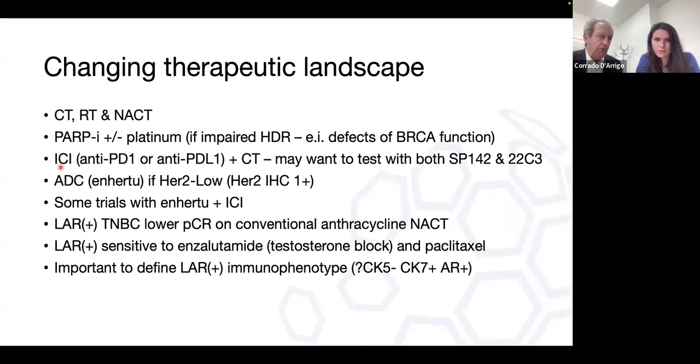We talked about immunocheckpoint inhibitors. There are two drugs, anti-PD-1 and anti-PD-L1. The mechanisms of action are different. Some cases respond to one and not to the other. It would be convenient for the oncologist to have both tests available, so that they know how they can play with this chemotherapy. So you may want to do both PD-L1 tests.